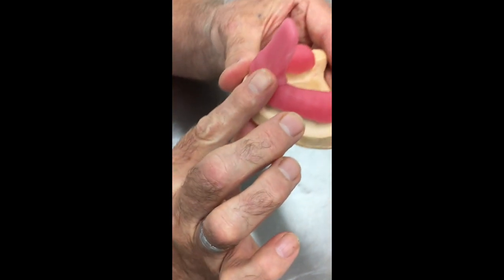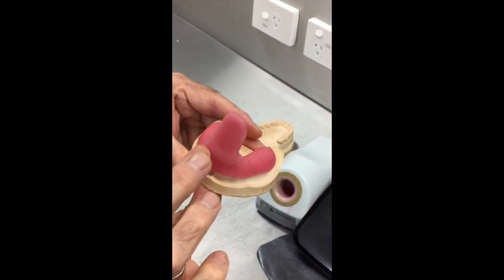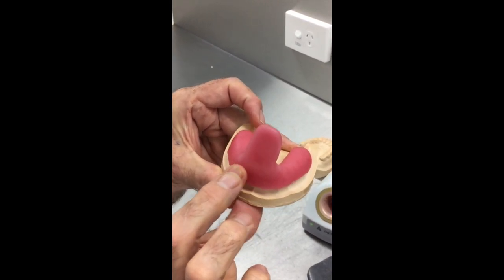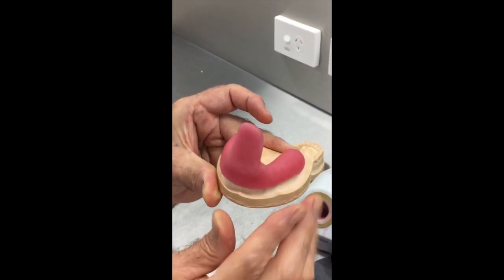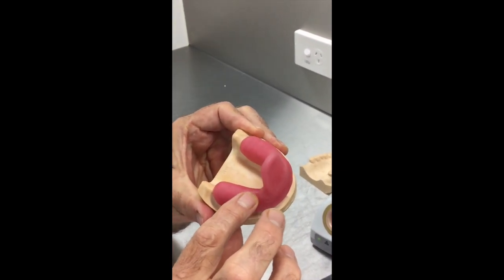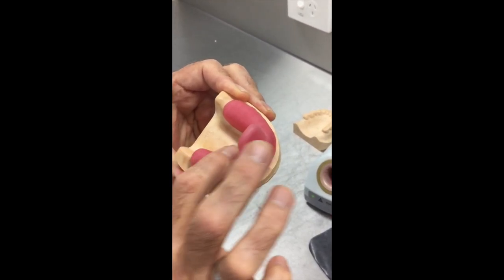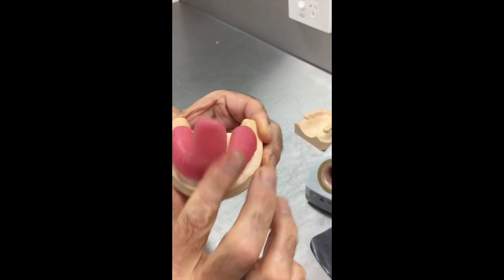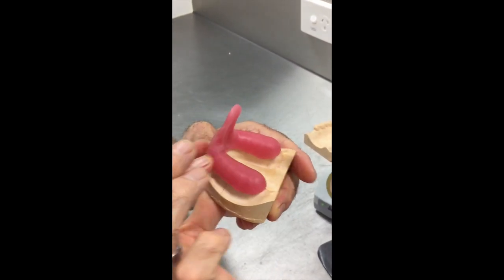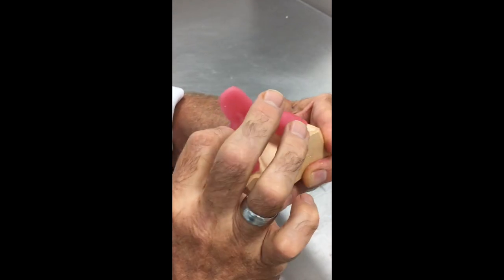All I'm doing now is spending the time to blend this handle in like so, and get the perfect, seamless join onto the tray. You can see how that's occurring, and the handle's not flopping or moving at all. It's in exactly the right position. And I can blend this handle in perfectly, all of that before I do any positioning of the handle to come out of the mouth.